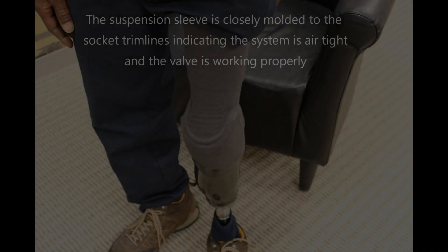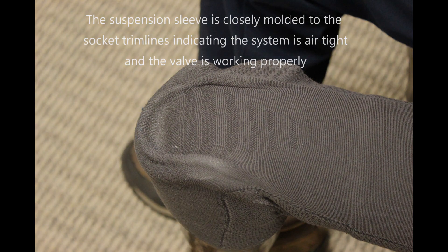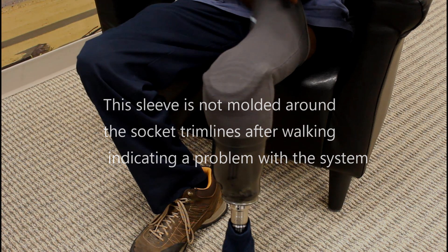If you allow air into the system by breaking the suspension sleeve seal, you will immediately feel and see the sleeve relax and leave the socket and liner surfaces as demonstrated here. If this occurs, you can be confident your system is working and is airtight. If this does not occur, it means you likely have a hole in the suspension sleeve or the one-way valve is not working properly. The socket will not fall off since the sleeve will hold the prosthetic in place, but you will not have suction and this will result in less control and more motion inside the socket, which can be painful. Your prosthetic clinician will need to fix these issues.